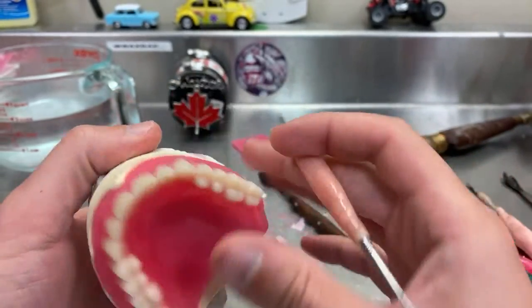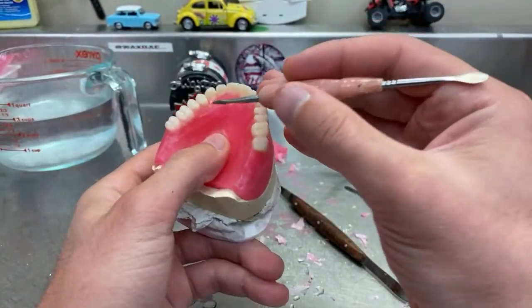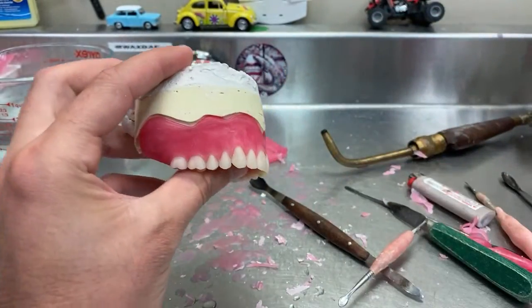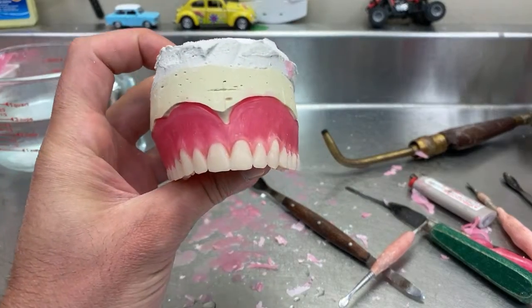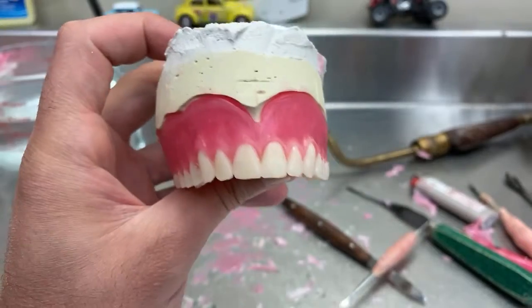Okay, so that's the carving. As I said, it's going for a try-in, so I don't want to have lingual and palatal carves, because you don't want saliva to get stuck in there. So far, this is the shape before flaming.